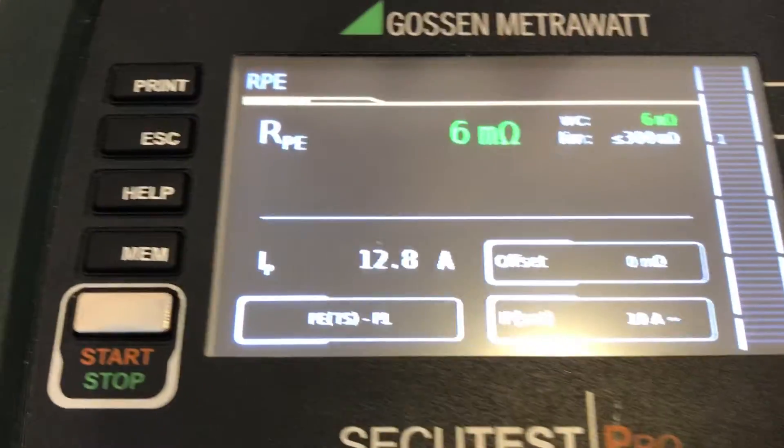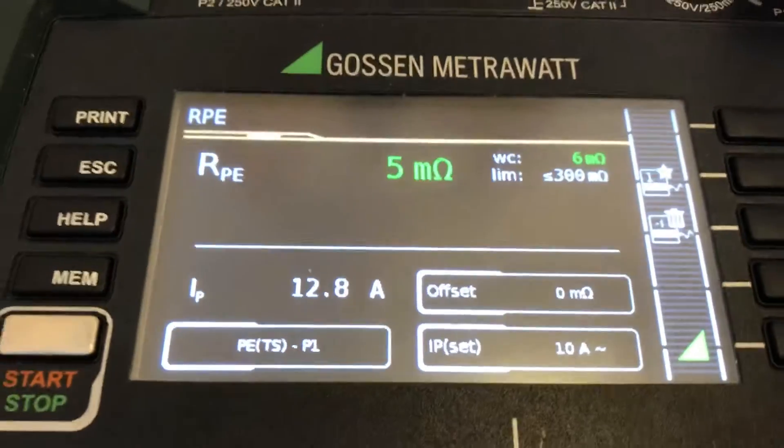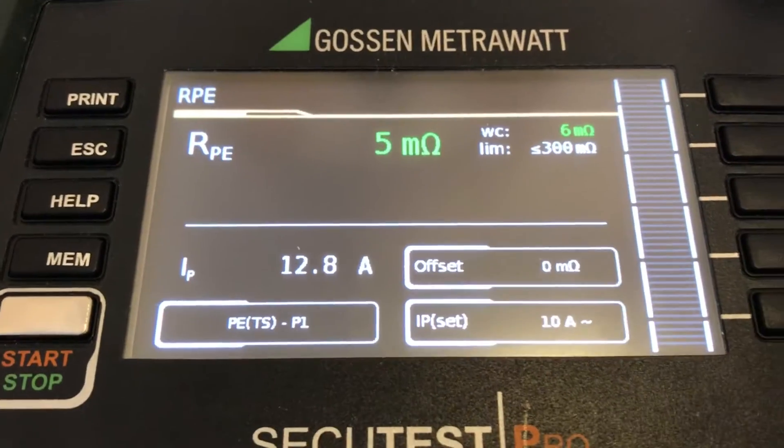So we're going to store this measurement. The good thing is that as long as that bar is running at the top, we have time to move up to the next point. Now we can conduct the next point and press start.